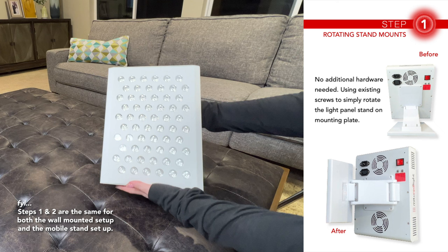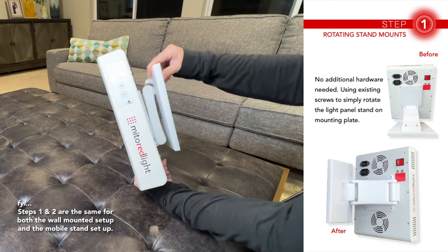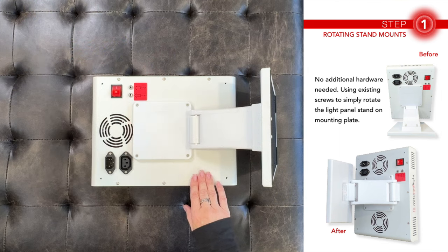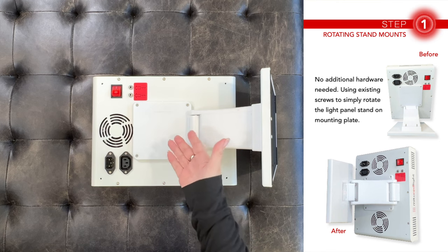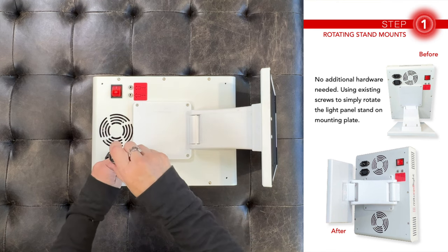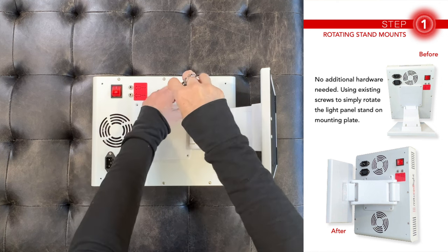This is what the Mido 300 panel looks like right out of the box with the stand attached. You'll be modifying two of them to be the side angled panels. Step one is rotating the stand. With this being a square, it works out perfect to change the direction. You won't need any additional hardware for this step — you'll simply be rotating the stand and reattaching it. Now remove all four screws from the plastic cover.